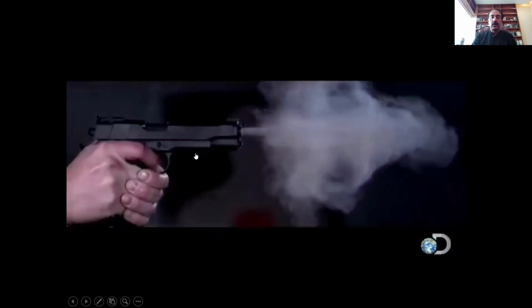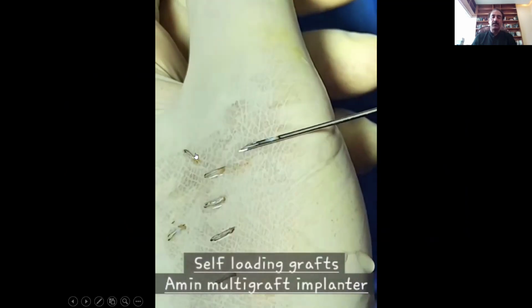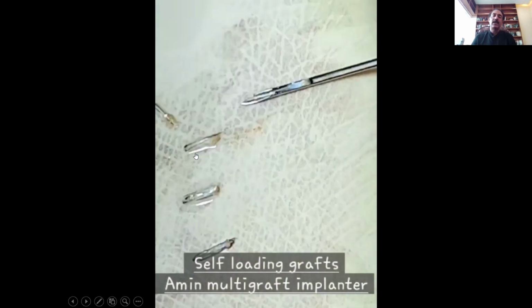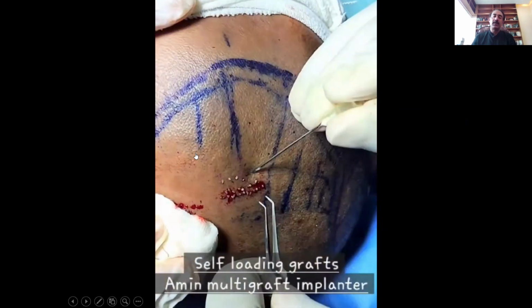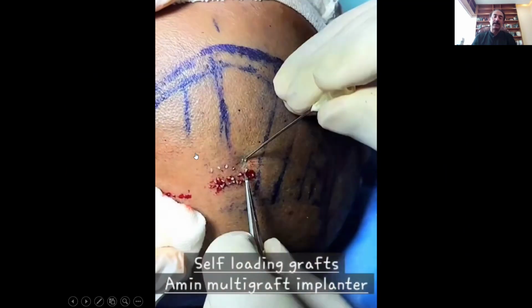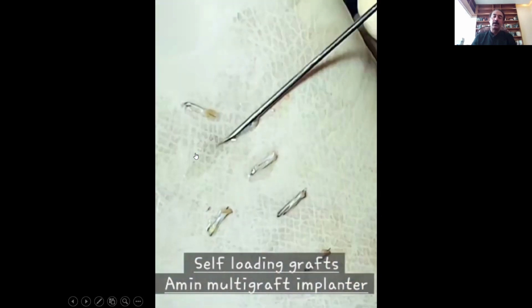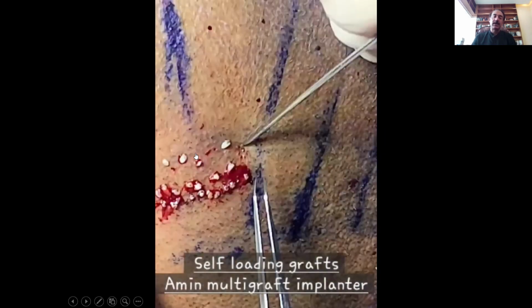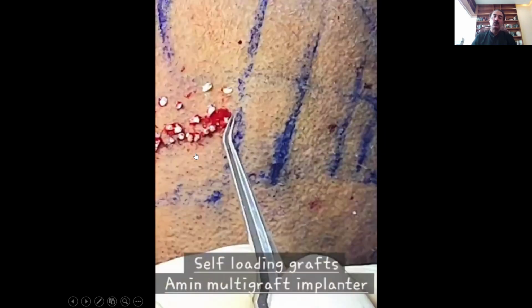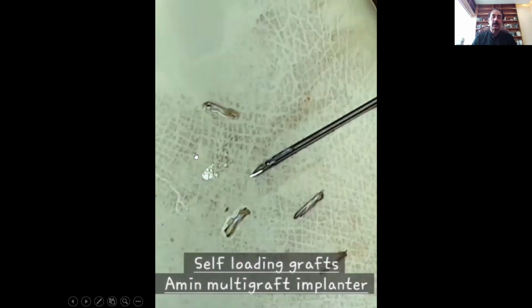It can be used as a single graft implanter, like a machine gun, like a bullet fire, like a Keep implanter. But you can use it both ways, like a sharp implanter, or like a Keep implanter in pre-made slits. And this is the technique with which we feed the graft in the implanter, and then we just inject it as a sharp implanter. You don't need too many technicians or placers for this procedure.